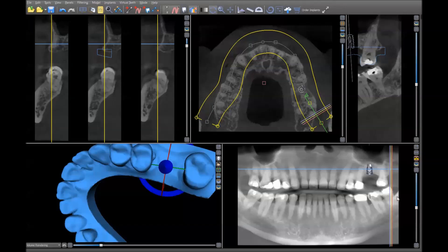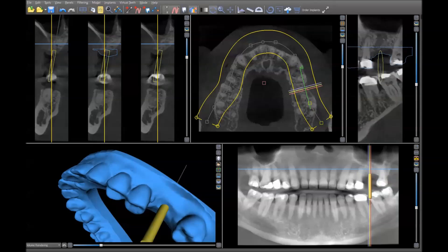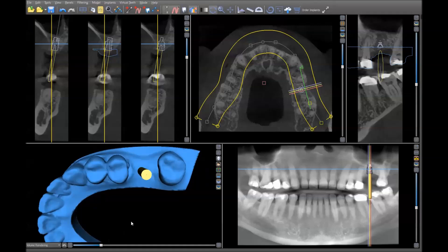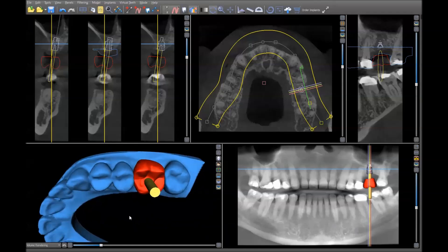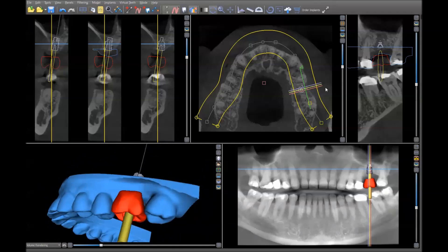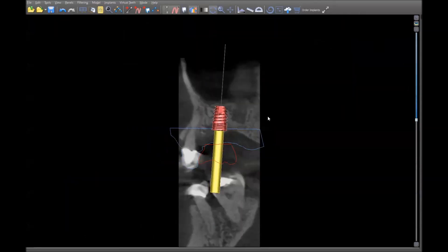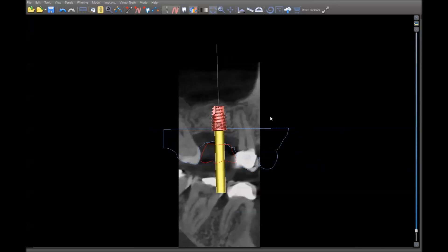I've already done that, so if we turn this on along with the abutment, we can see that this is emerging through an ideal prosthetic position. If you want to verify that further, you can put in an artificial tooth and evaluate how the implant will emerge through that. And if we evaluate the implant itself, we can spin around its axis and make sure that we are fully in bone all the way around.